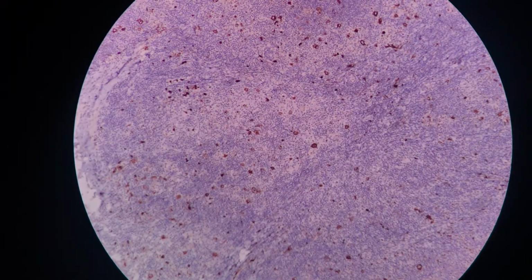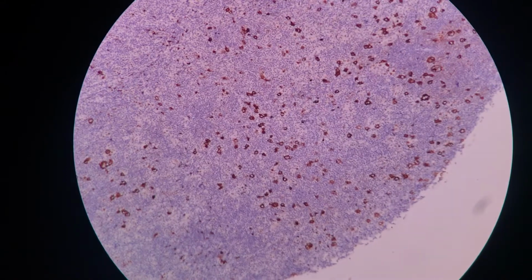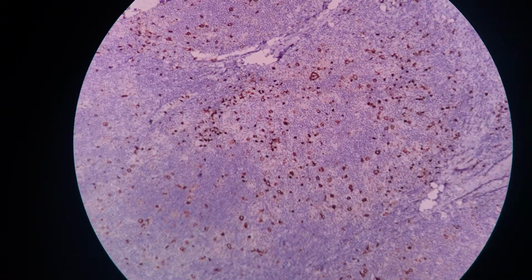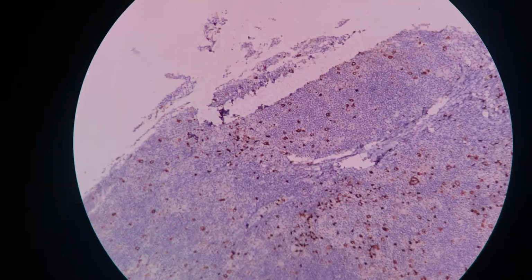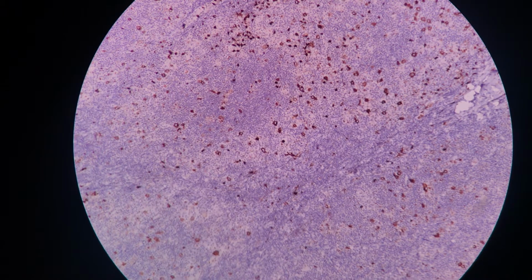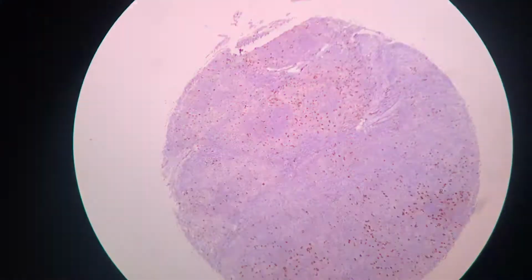We will try to see if there is any germinal center and whether there is staining over there or not. We couldn't find any germinal center over here. So let's move on to the other case, that is kidney.